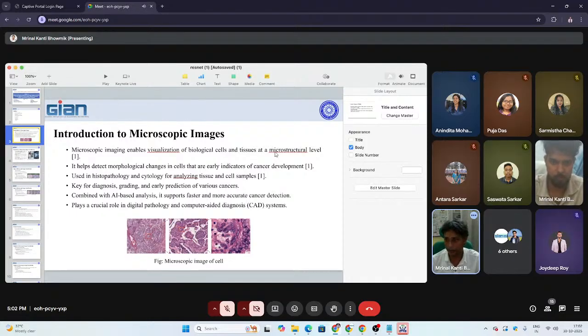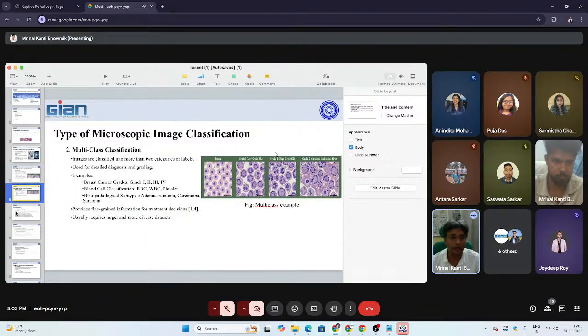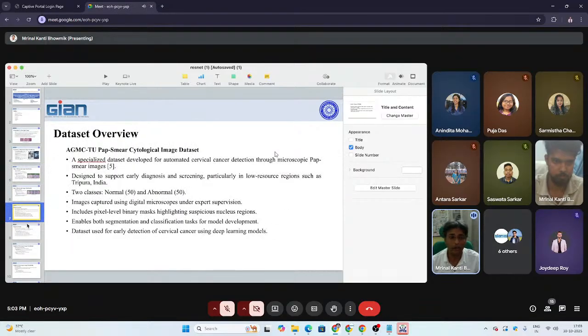I think everyone knows the total thing, they have understood. So you should go to the precise parts, those that are most important for the implementation of anything in this cell biology, and how to go through your main curriculum, the main hands-on. So you can start, Joydeep.